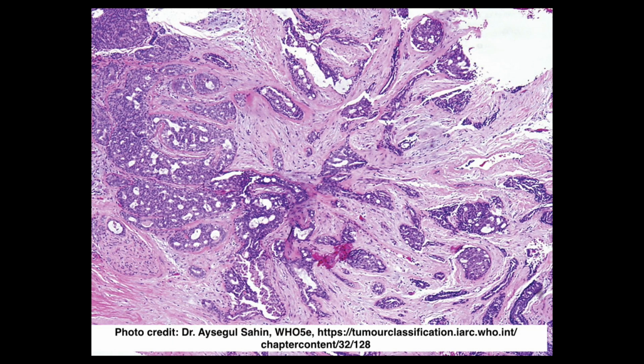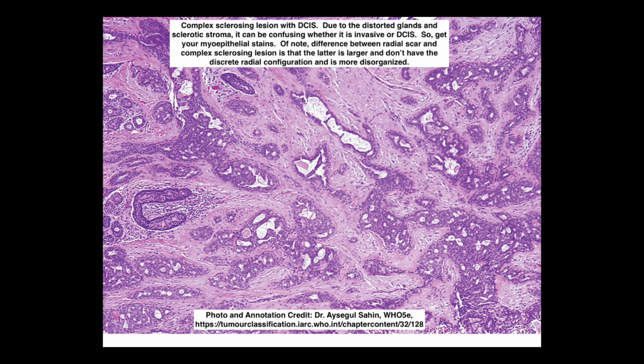So this is another complex sclerosing lesion with some atypia here. And here's another view of this complex sclerosing lesion with DCIS.